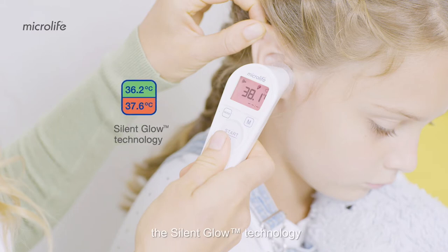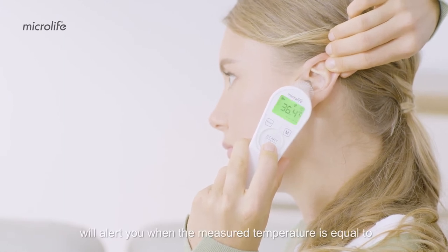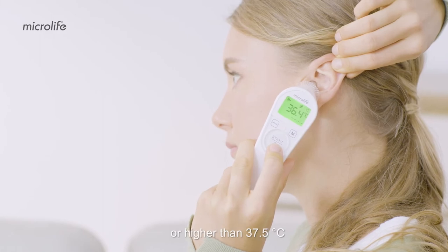The Silent Glow technology enables you to easily read your temperature. Ten short beeps and a red LCD backlight will alert you when the measured temperature is equal to or higher than 37.5 degrees Celsius.